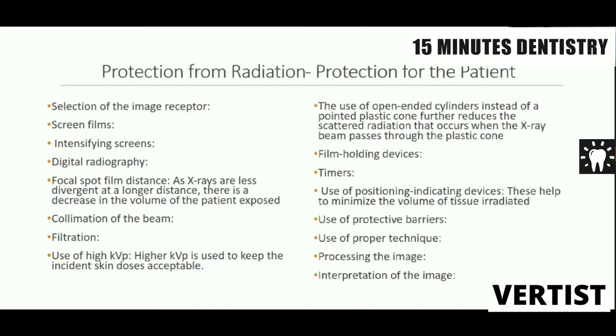Taking a radiograph is not enough. If the technique that you have used is not proper, you will not get a good image. If you don't process it properly, you will not get a good image. And after doing all this, if you don't know the interpretation and you are not able to interpret properly, the entire exercise is wasted.